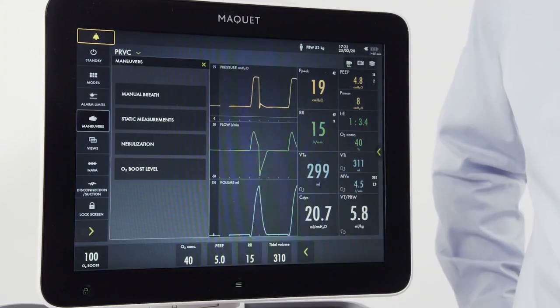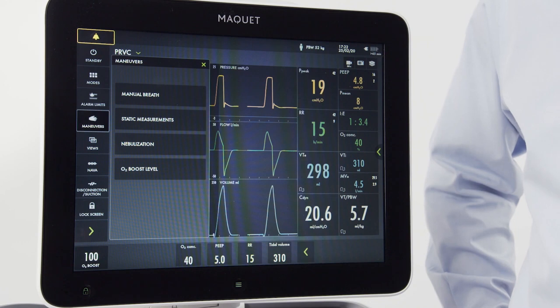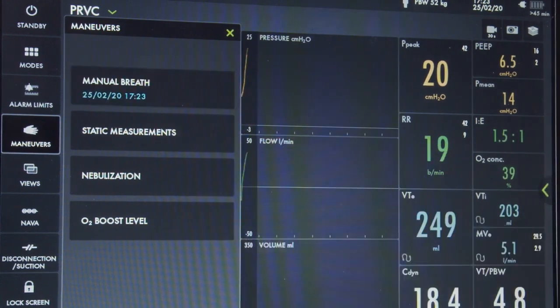When I press maneuvers, I have four options. We've already talked about the O2 boost level. The manual breath button, when tapped, will initiate a new breath cycle according to the current ventilator settings.